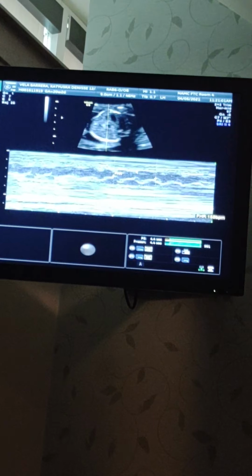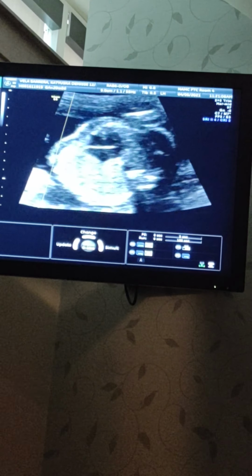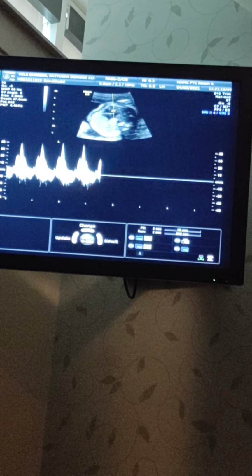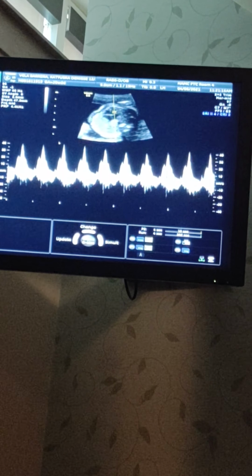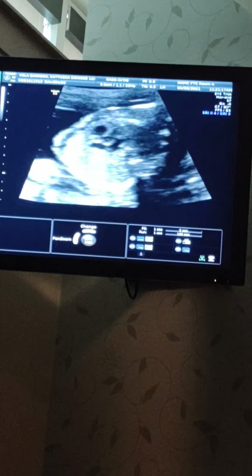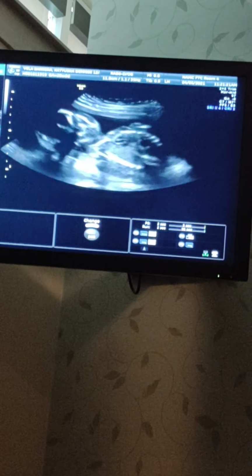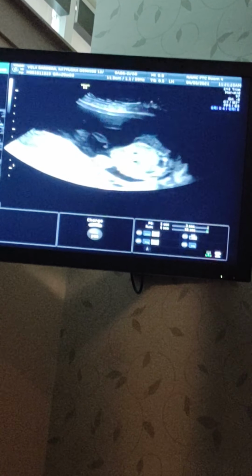So, okay, 155 is your baby's heart rate. Now we're going to listen to the heart for a minute here. There you go. Very nice. Let me know when to look away. I will. Don't worry.